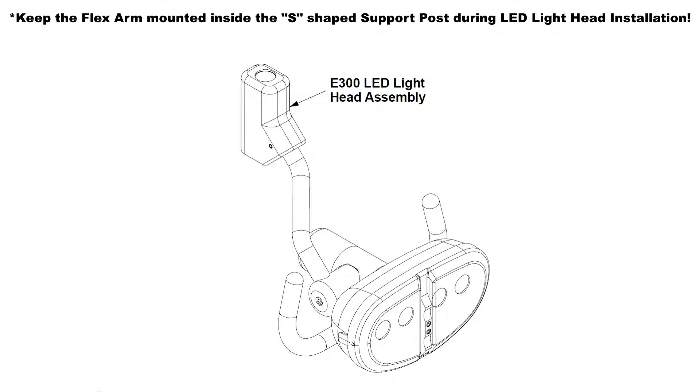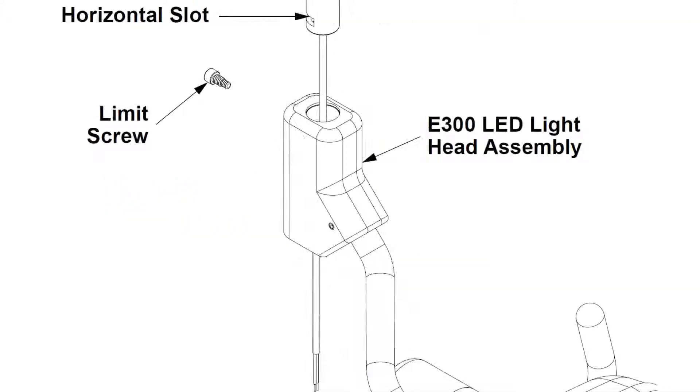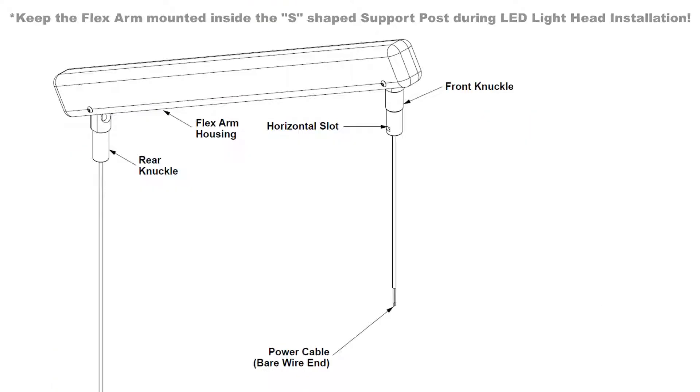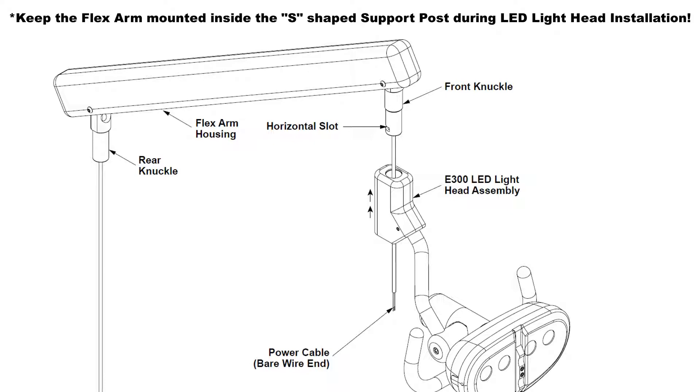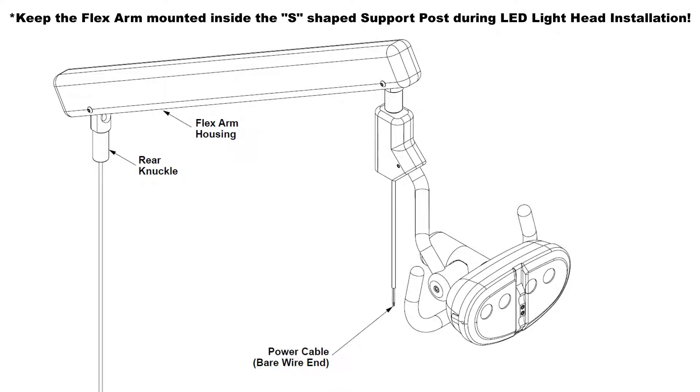Remove the power switch assembly from the E300 LED light head assembly by unfastening the two button head screws. Apply red Loctite or an equivalent thread lock to the limit screw threads per the manufacturer's instructions, then set it aside. Route the bare wire end of the LED wiring harness through the light head arm connector. Secure the E300 light head assembly to the flex arm front knuckle by aligning the screw hole on the light head arm connector to the horizontal slot on the front knuckle, then fasten and secure the limit screw.